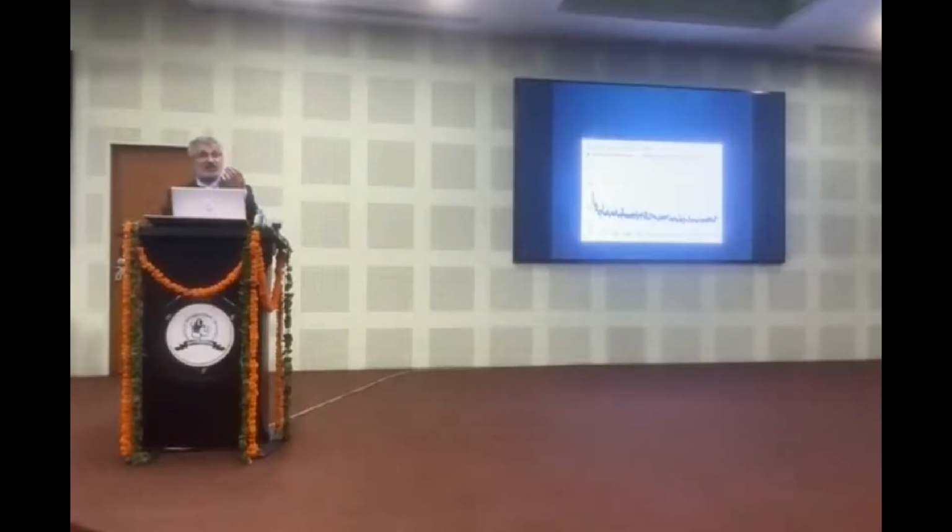These are the risks for nerve irritation. Number one is location. The farthest level has 2.5 times more rate of nerve irritation than any other level. Number two is how many passes you do below the transverse process. More than 3 passes for one level and more than 7 total passes seems to be 1.8 times more risk of nerve irritation.